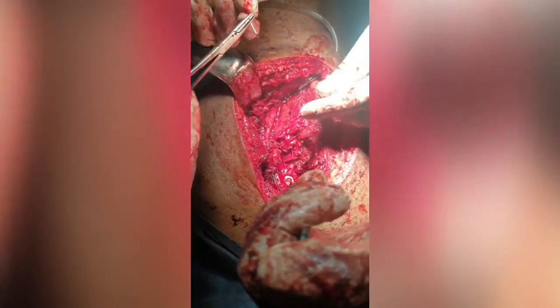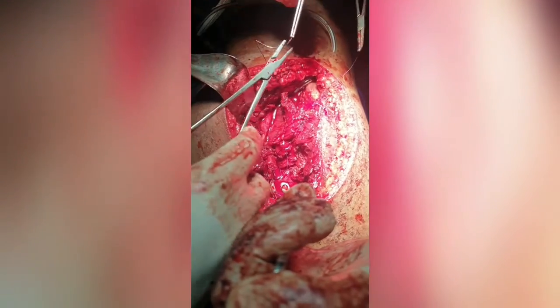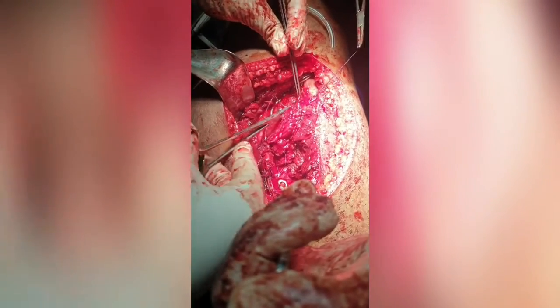So we are repairing the quadratus femoris muscle, the short external rotator of the hip.